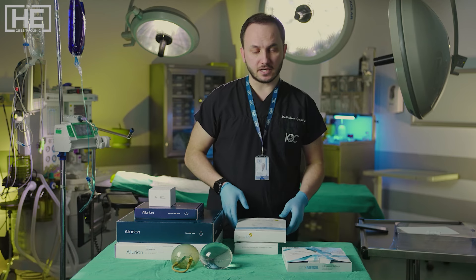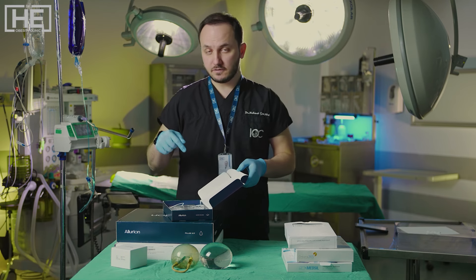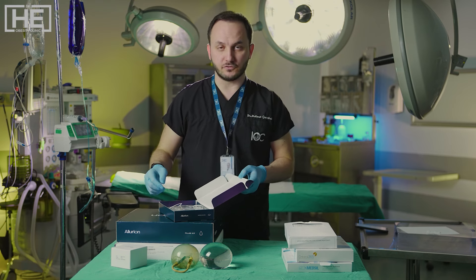Let's start with the Allurion. This balloon has some advantages. We don't need endoscopy, we don't need anesthesia, and you don't need to come back for gastric balloon removal.